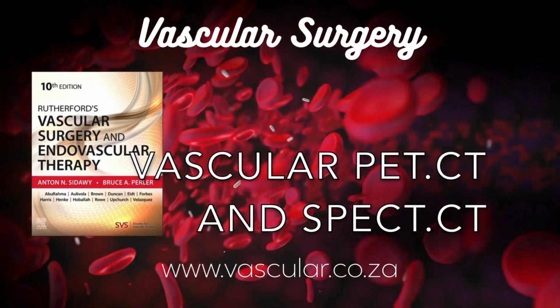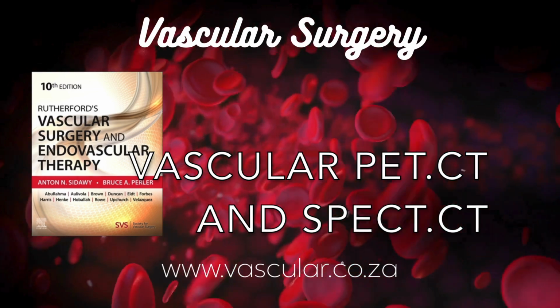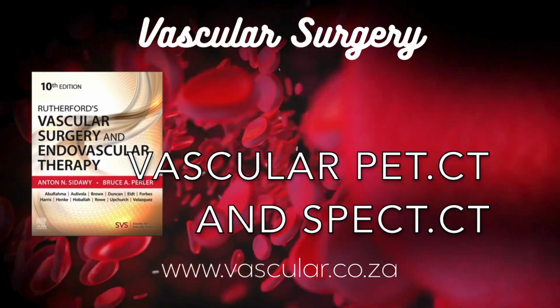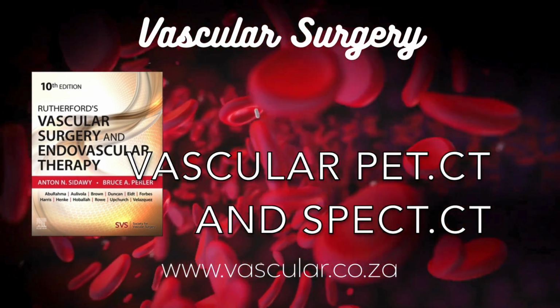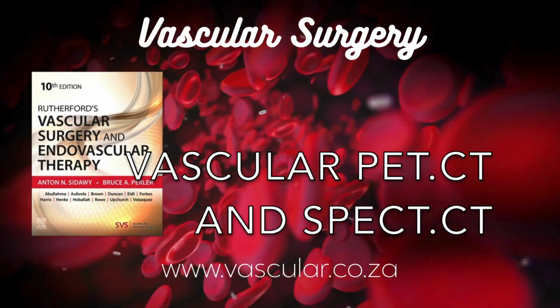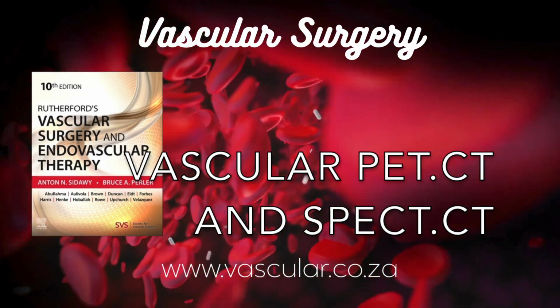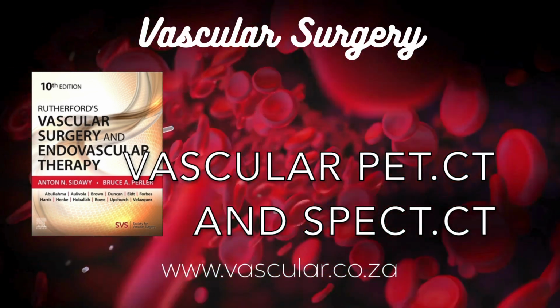Makes total sense. Okay, let's talk tracers. These molecular spies. What are the main ones used for looking at vascular problems? Well, probably the most widely used one, even in vascular imaging now, is 18F-fluorodeoxyglucose, FDG. FDG, I've heard that mentioned a lot with cancer scans. You have. Because cancer cells are often highly metabolic, they gobble up glucose. FDG is basically a glucose mimic. So it looks like sugar to the cells.